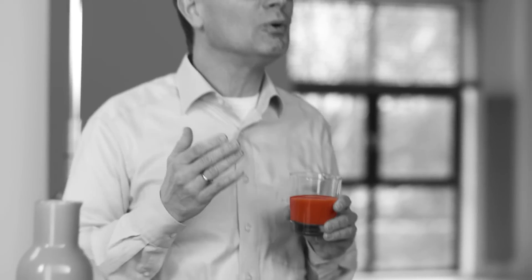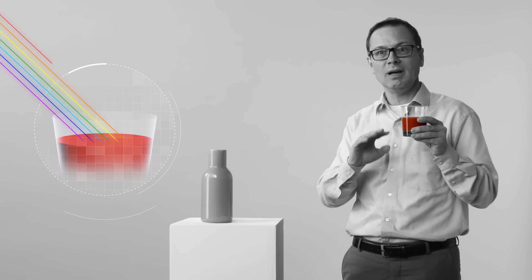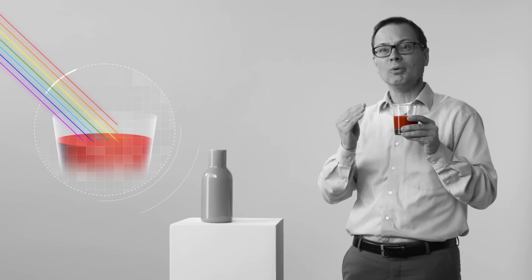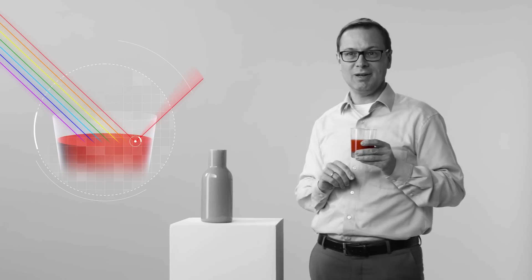Well, you all know that white light contains all colors. And if the white light around me hits the surface of the tomato juice, all colors except for red are absorbed. Only red is reflected, and that's how it reaches your eyes.